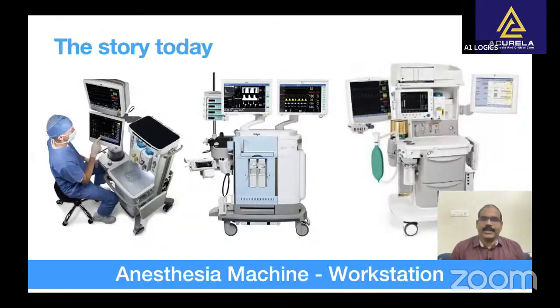The story kept developing, and today we have Anaesthesia Workstation, defined as a system for the administration of anesthesia to patients consisting of the gas delivery system, breathing system, anesthetic gas scavenging system, anesthetic vapor delivery system, anesthesia ventilator, and associated monitoring and protection devices.